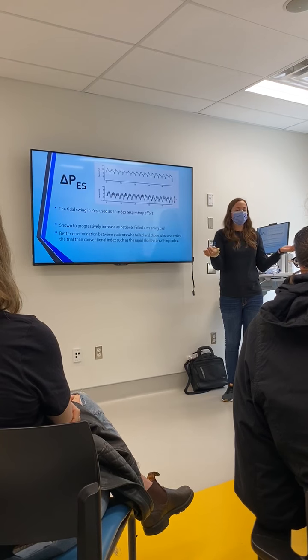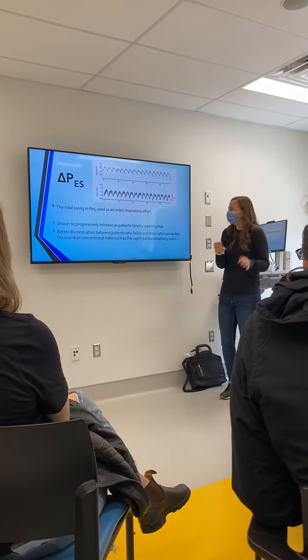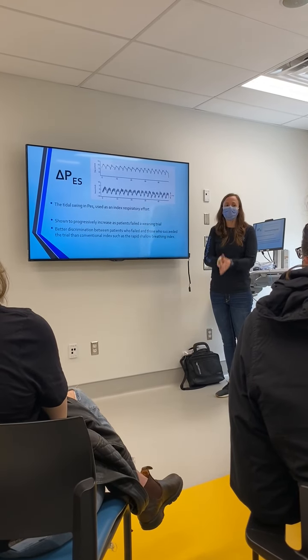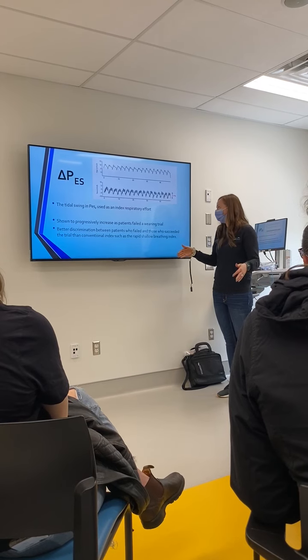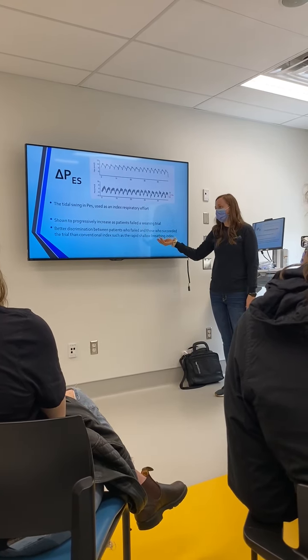Respiratory rate is driven by what? Could be neuro, it could be drive, it could be really anything. But this is showing you actual work from your patient, right? This is them actually changing their lung volume. So if they're working too hard, then they might fail when they're extubated.